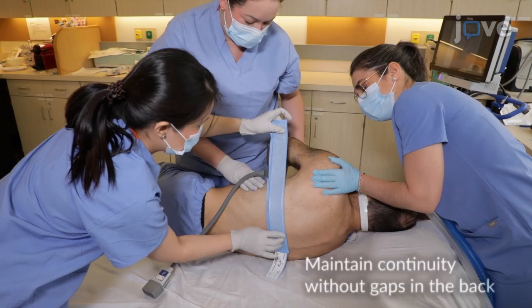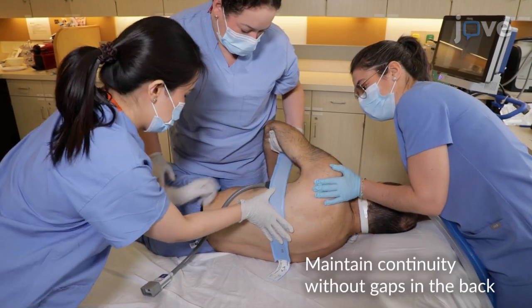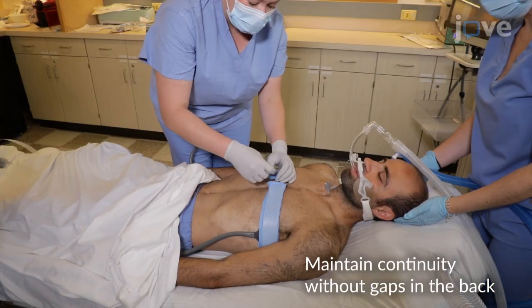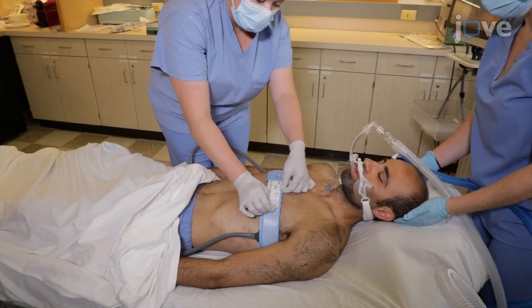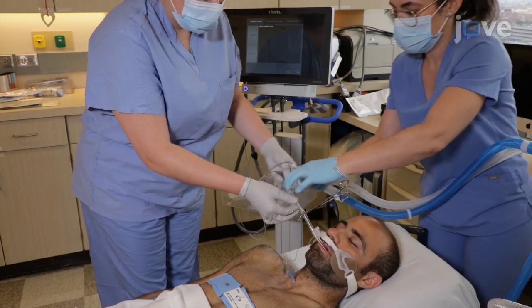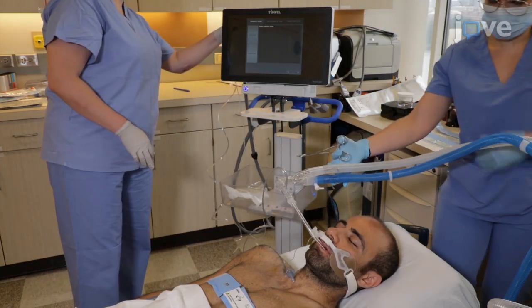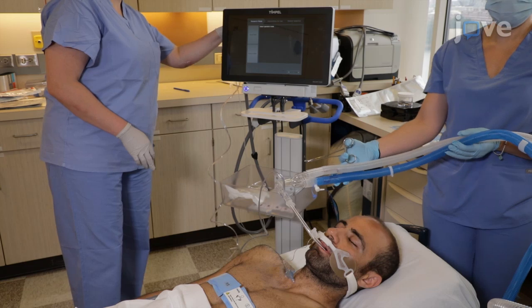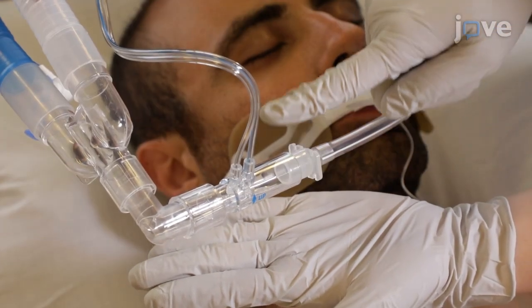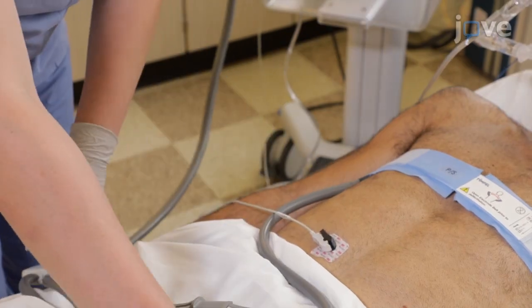Cover the electrode belt with disposable material and conductive gel. Place the belt on the fourth and fifth intercostal spaces of the patient's chest wall, ensuring no overlap with the electrodes. Connect the flow sensor to the ventilatory circuit close to the Y piece and position it with the sensor upwards to prevent fluid accumulation or signal interference.